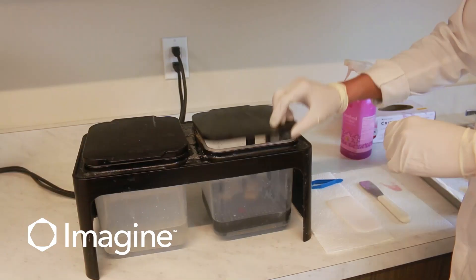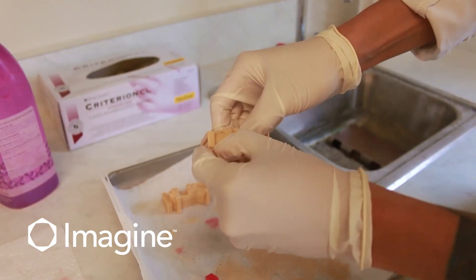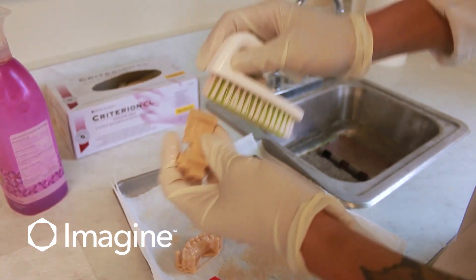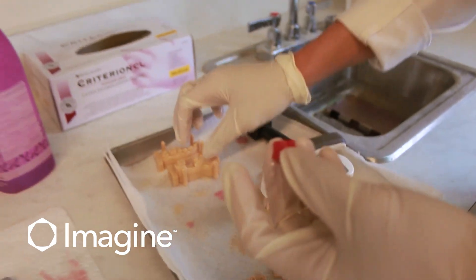After about five minutes, we're going to remove the units. At this step, you can remove the connectors and then clean the unit one more time with that soft brush. For our gingiva, we'll leave the connectors there just because we don't want to break any of that off.